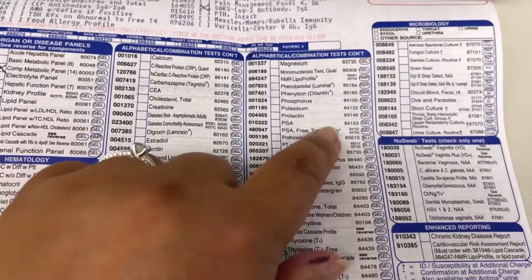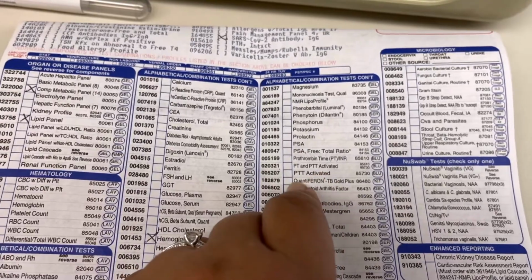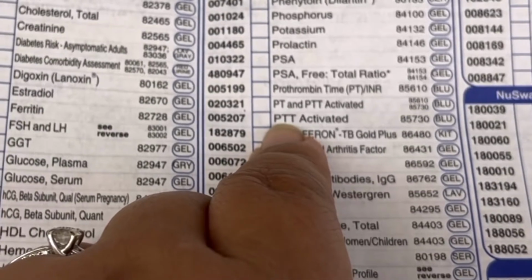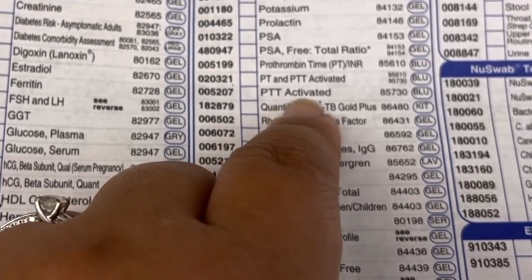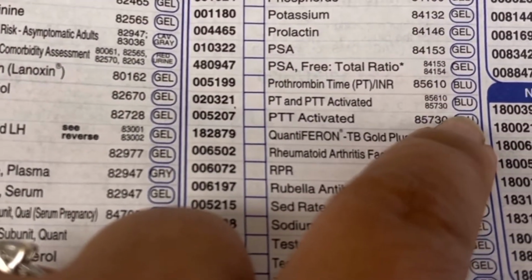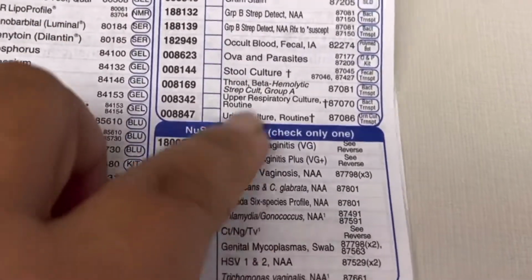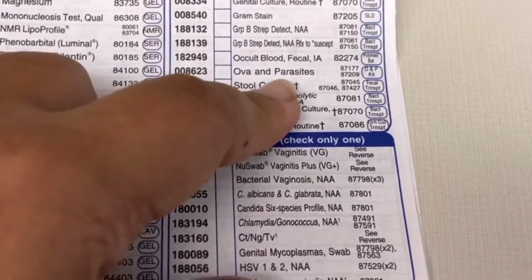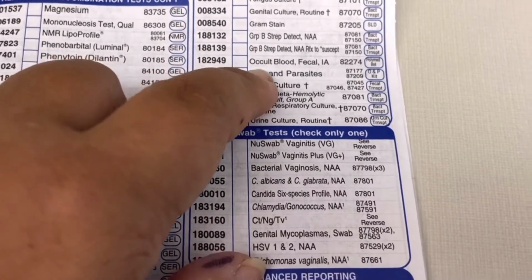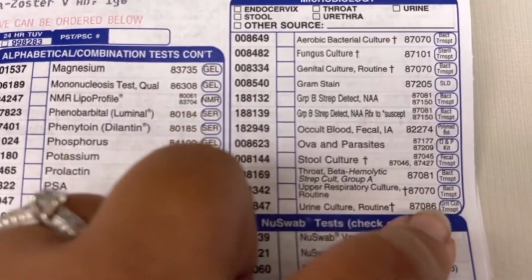What else? So you can see right here, PT and PTT. These are the most common coagulation testing. And it'll tell you that it goes in a blue top tube right here. See, it's pretty easy. These are all micro testing. I don't usually do this, but I know that these probably go in a swab or something, and it'll tell you what toolkit it goes into.